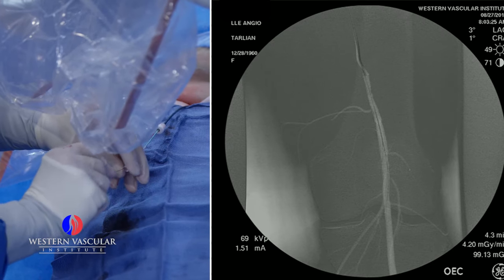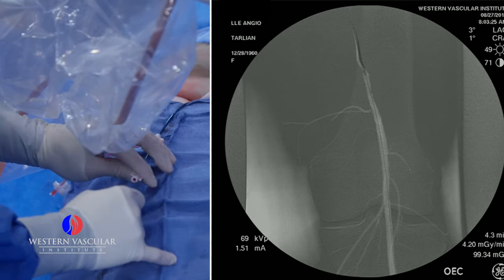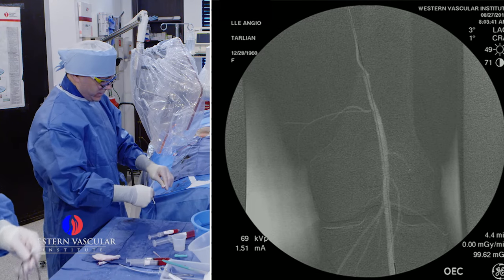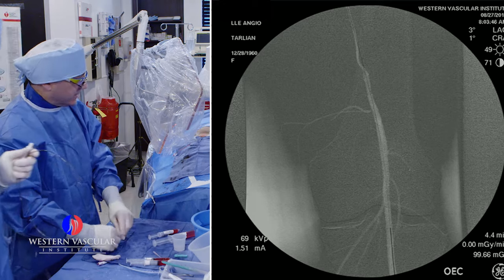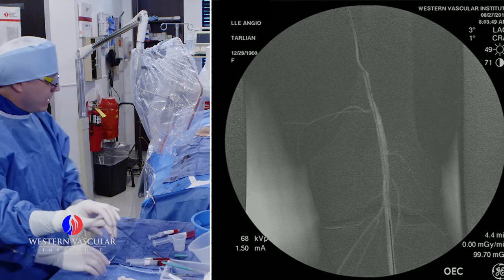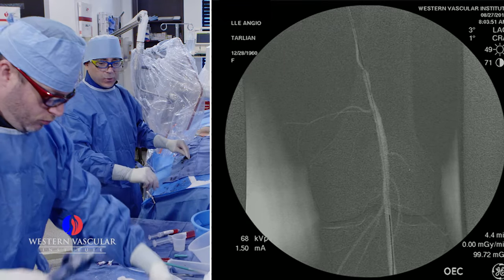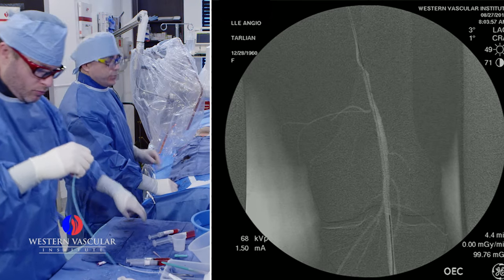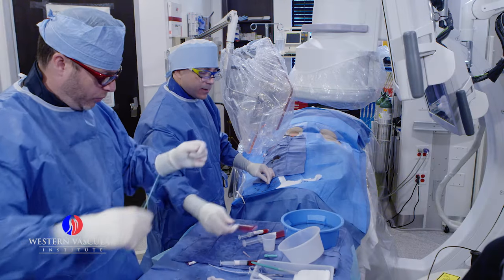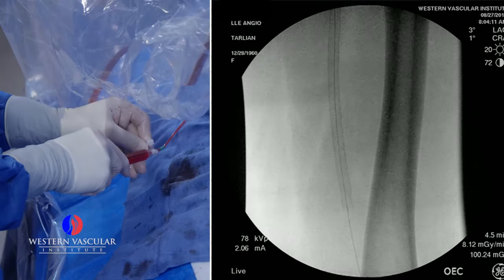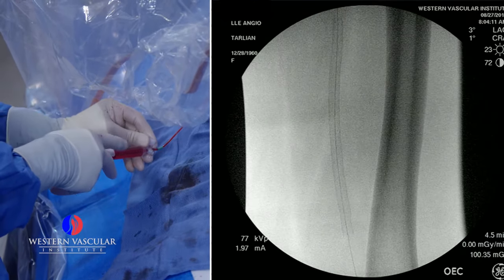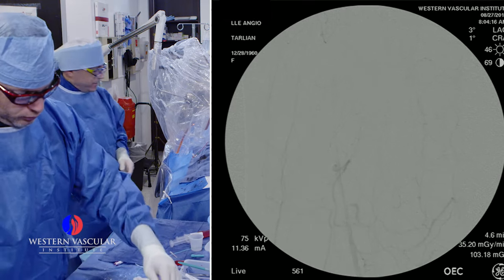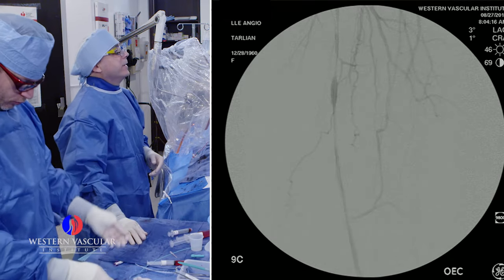On the screen you can see the markings of where the artery is. We use the road map to make sure our wire is where we need it to be. When we're treating narrowings in the arteries, we like to be able to see exactly where the narrowings are without having to keep giving the patient more and more contrast or dye, which can be toxic to the patient's kidneys if you use too much of it. And now we just took a good picture of the area of narrowing you can see in the stent.